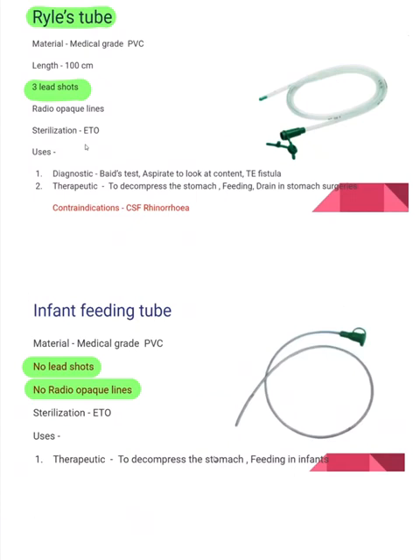Now coming on to some other instrument. That is the Ryle's tube, guys. So how do you identify this Ryle's tube and the infant feeding tube? I often get confused between Ryle's tube and infant feeding tube. This Ryle's tube has a length of around 100 centimeter, and you see the presence of 3 lead shots, guys. And there is a radio opaque line, which I don't think will be visualized.